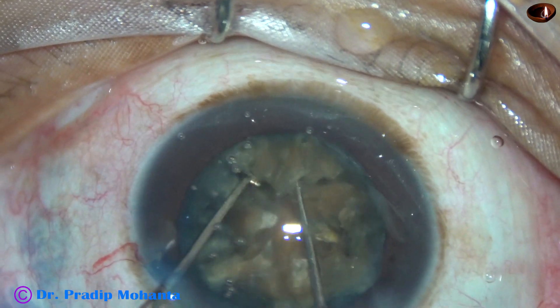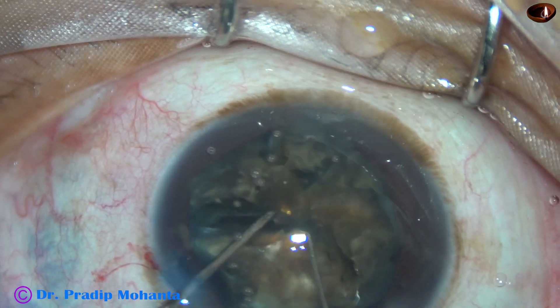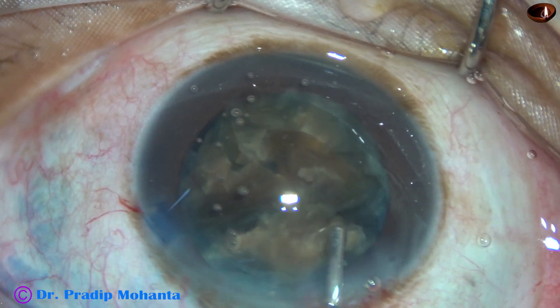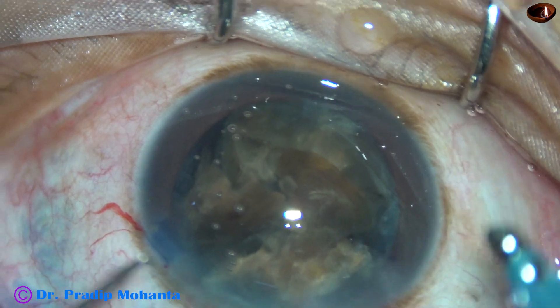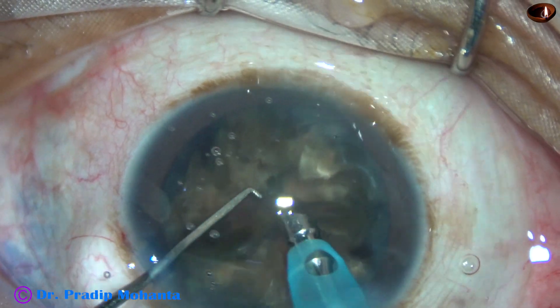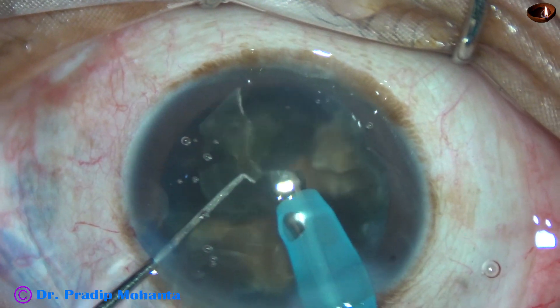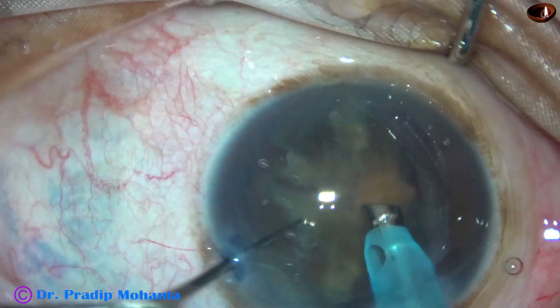I rotate, come to the other hemi-nucleus — the pieces are still joined. Now 6 completely free pieces are there. I inject some visco and go into the anterior chamber with 85% to 90% ultrasonic energy in continuous mode. This is Oertly Catarix 3. I use ultrasonic energy only when the tip is occluded, so there is intermittent application though the ultrasound is in continuous mode.